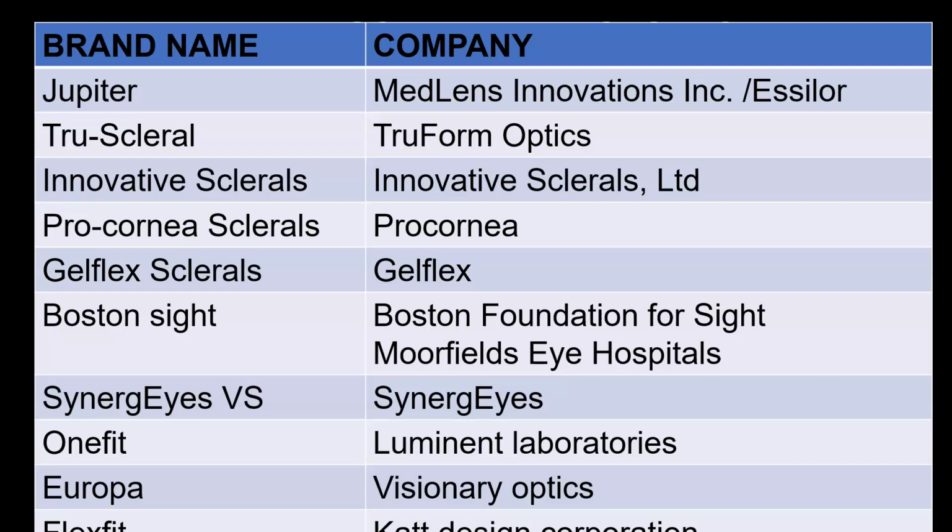But most of the brands will have a different makeup of the lens. So they have different lens materials. Some will have lens materials with better Dk, better oxygen permeability. Others will have materials with lower. There may be a need for you to change lens material because the patient is not comfortable at the end of the fit, and the patient is still having blurry vision. You've done other things, you've assessed the fitting, and everything is fine. So those are things to bear in mind.